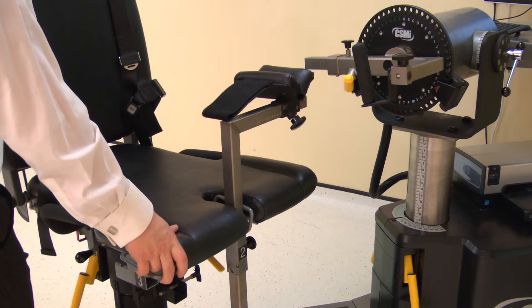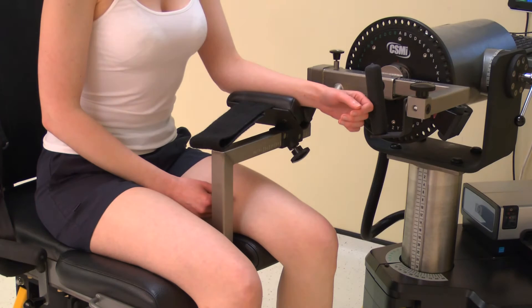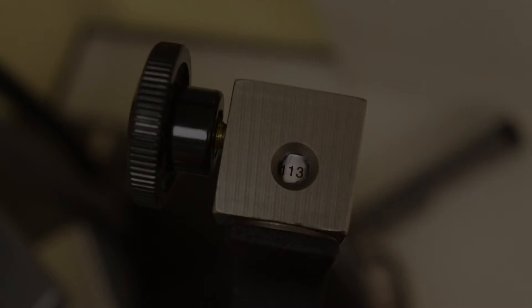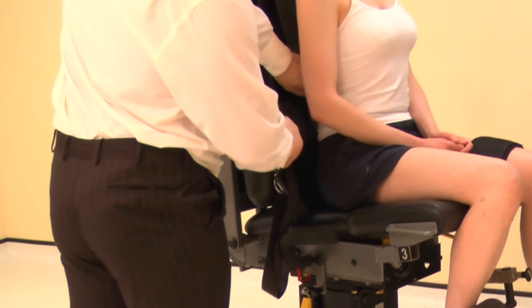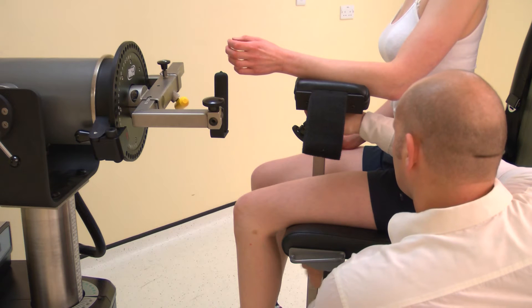Fine tune the monorail so the stabilizer aligns with the handle. Once positioned, ask the subject to sit on the chair and rest their forearm on the stabilizer. Rotate the handle to position 113 by loosening the screw and rotating. The chair back translation may be adjusted at this stage to support the trunk. Use of the lumbar cushion may be necessary for comfort. Then adjust the height of the stabilizer to attain the correct elbow angle.